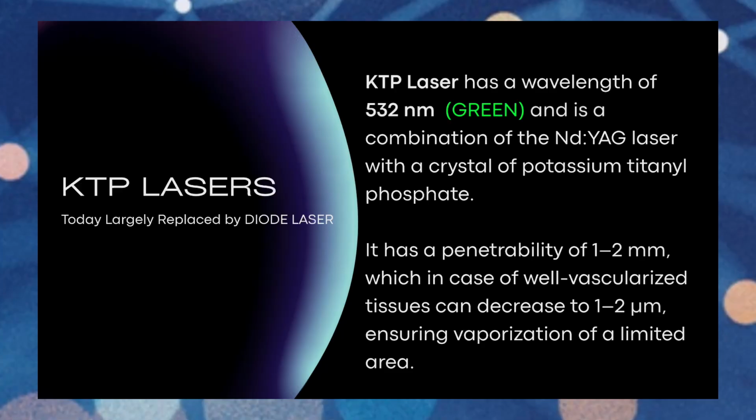we used it in stapedotomy as well, and it can have a very nice low penetration so long as it's used carefully, because it will penetrate through the water, right? So in the visible range, these go through the water. So when you get to the footplate, you have to back off your aggressiveness and try to avoid re-hitting. So you cannot do double hits on an open hole.